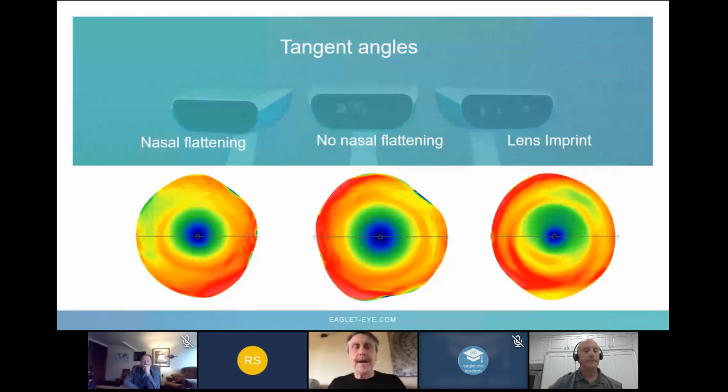Yeah, I've done it where I've done one eye one week and one eye the next, so they can function with one eye compared to the other one. And there was a discussion last week about, and I can't remember who it was that said, but preloading, I think you, Barry, preloading the functionality of moisture. So putting a lot of drops in.